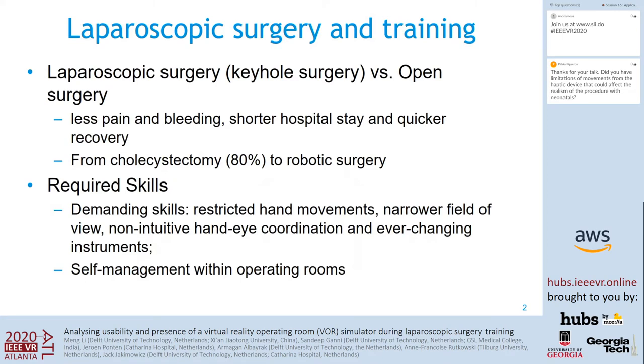As we know, laparoscopic surgery has received a lot of attention recently due to its benefits versus open surgery. For example, less pain and bleeding, shorter hospital stay, and quicker recovery. It is also one of the most developing fields of the surgery area. For example, cholecystectomy is now a standard procedure, and robotic surgery is the most advancing field of laparoscopic surgery.